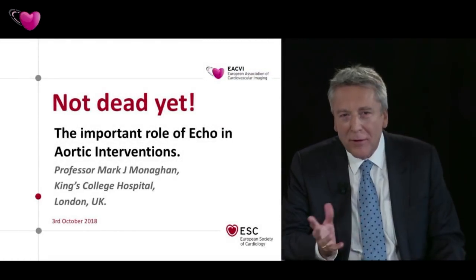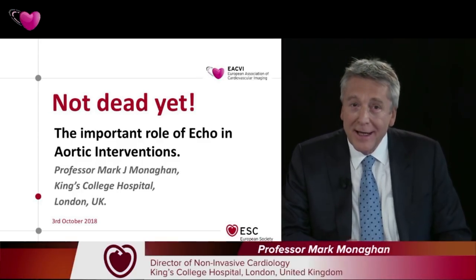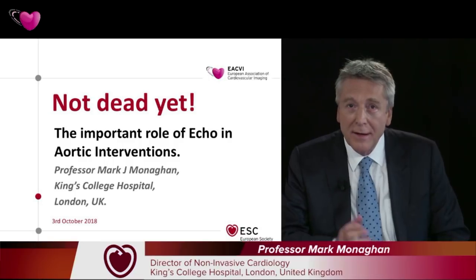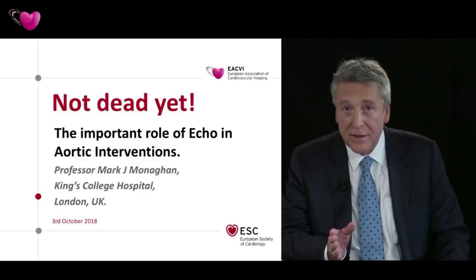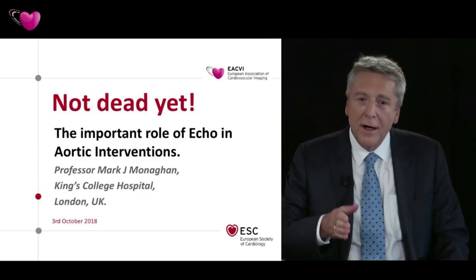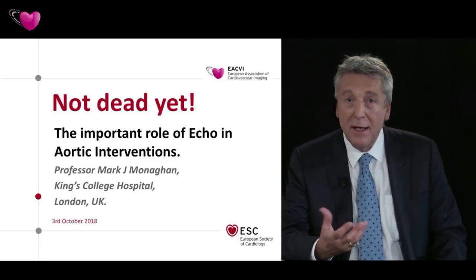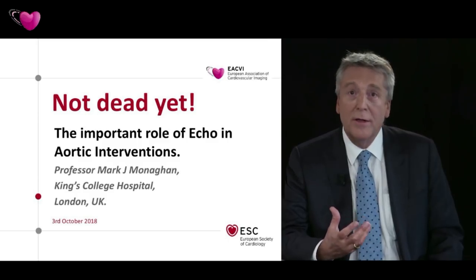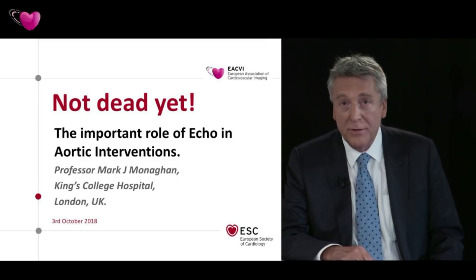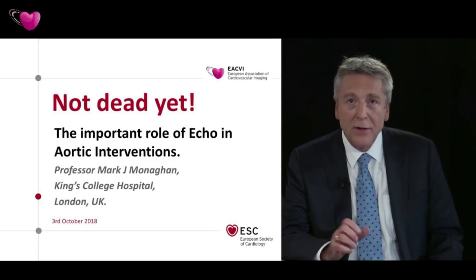Yes, I've given my presentation a slightly provocative title, because I've said not dead yet. And echo, of course, I think everyone would agree, and Mark showed it nicely in his case, is pivotal in terms of the diagnosis of aortic stenosis. But in terms of actually guiding a TAVI procedure or even the workup of it, many centres have moved away from echo now and they're using CT. But of course, we all know that there are patients in whom it's not possible to do a CT. And I think it's useful to have echo as another modality that you can use.